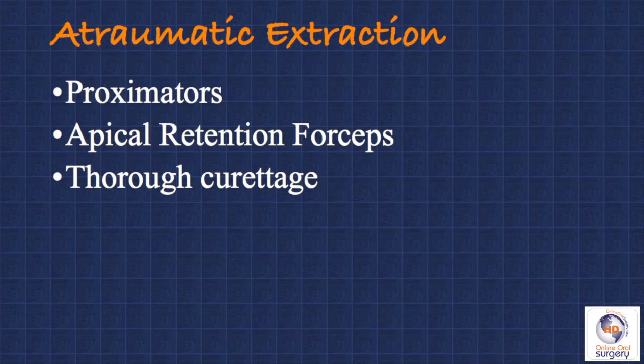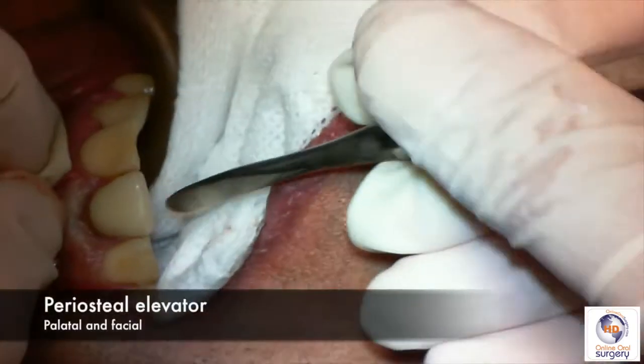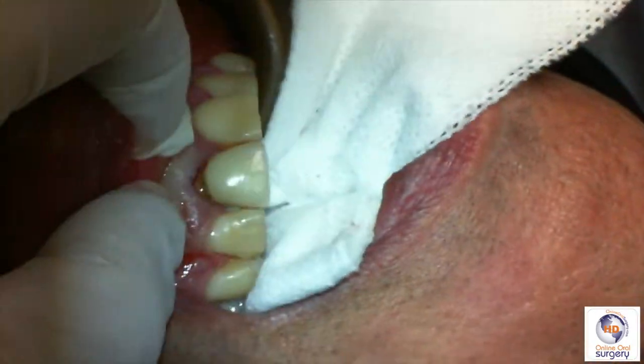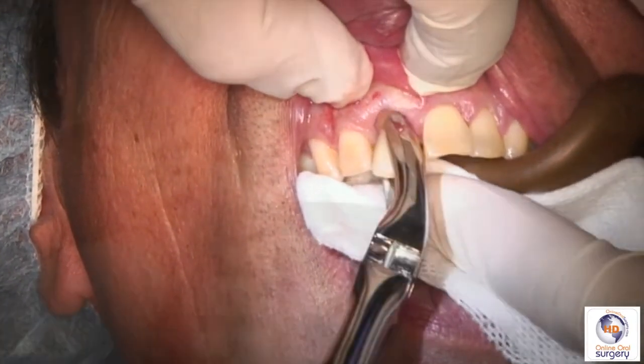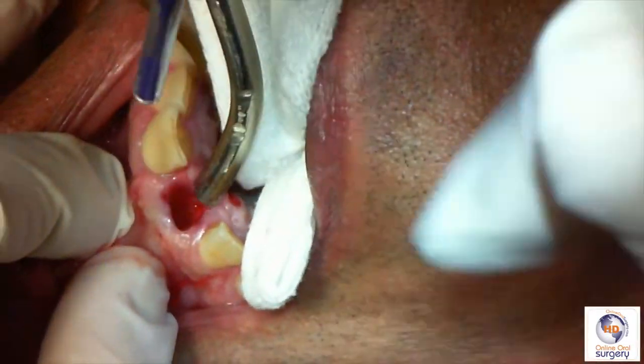Getting the best functional and aesthetic results with implant placement starts with removal of the tooth, and it's even more critical with an immediate implant in the anterior aesthetic zone. To accomplish our extraction, we're going to be using atraumatic extraction technique. This involves the use of specific atraumatic extraction instruments — the ones I like best are proximators and apical retention forceps. We begin by using a periosteal elevator on the palatal and facial aspects to relieve the soft tissue. Then we come in with our apical retention forcep, which we place sub-gingivally and rotate the tooth back and forth, luxate it buccal-lingually, and in this case the tooth comes out very easily.